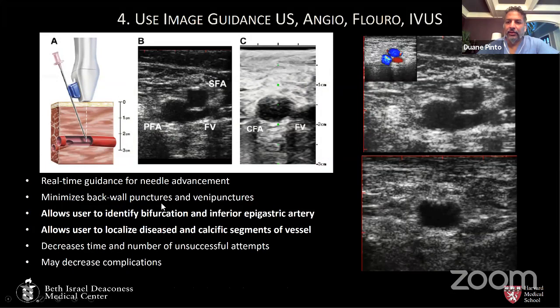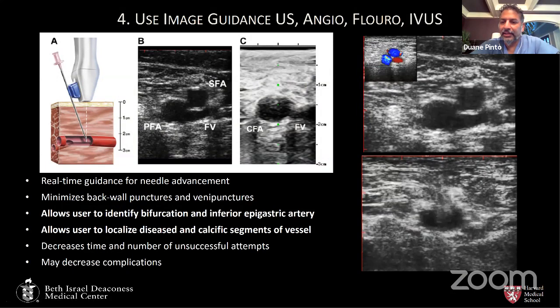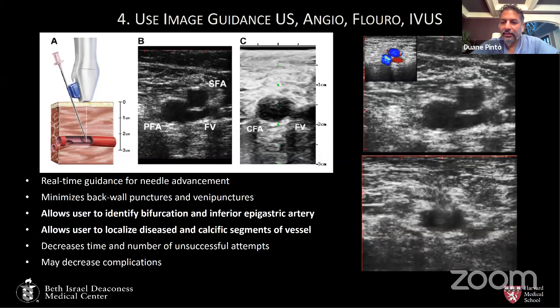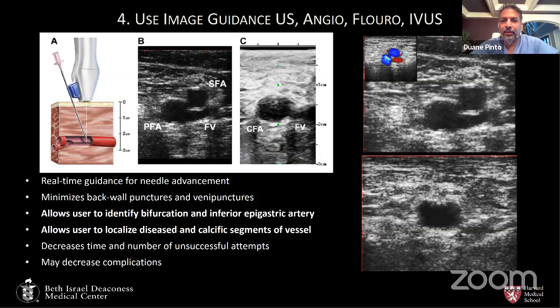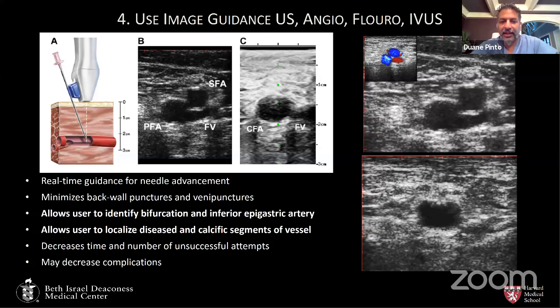Okay, so here's an example of really seeing the needle go into the artery at 12 o'clock. In this case, it's a stick where you see the artery is quite nice in this view, but you will also be able to see whether there's calcification or disease or posterior plaque. In some cases, when you see posterior plaque, you may wish to avoid that area or be careful when you're advancing the wire so as not to rough up the plaque.